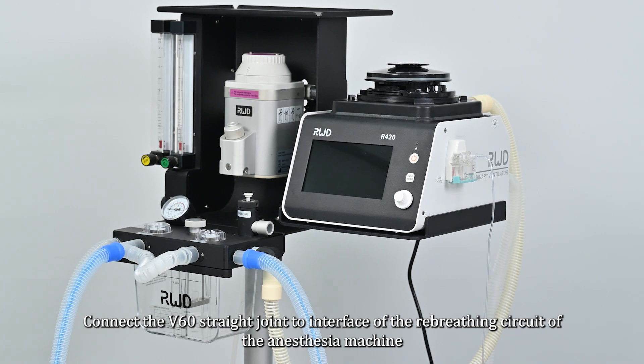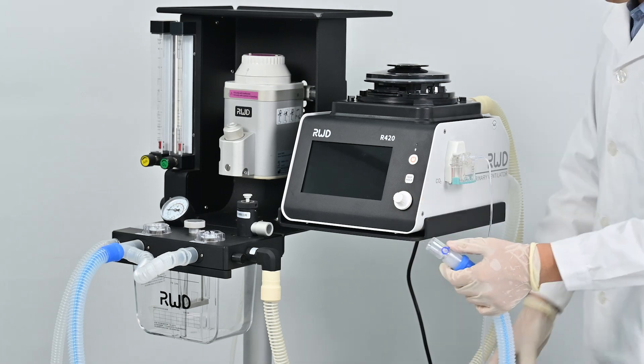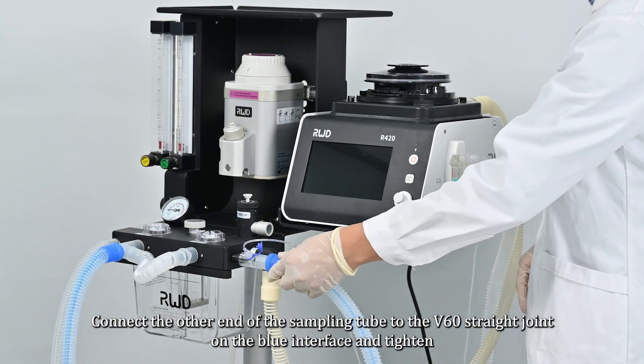Connect the V60 straight joint to the interface of the Y-breathing circuit of the anesthesia machine. Connect the other end of the sampling tube to the V60 straight joint on the blue interface and tighten it.